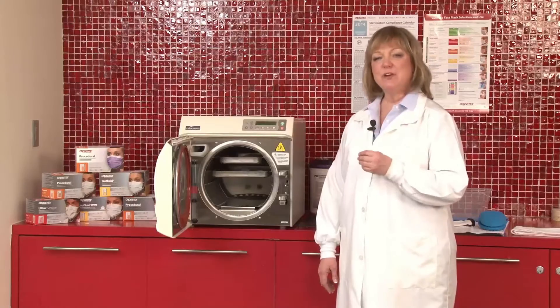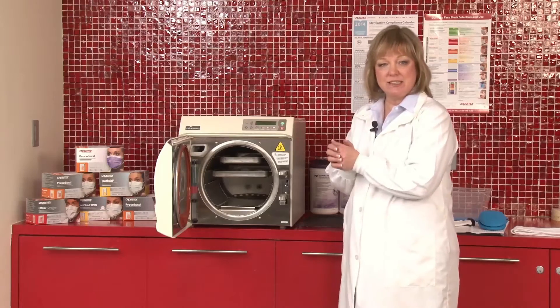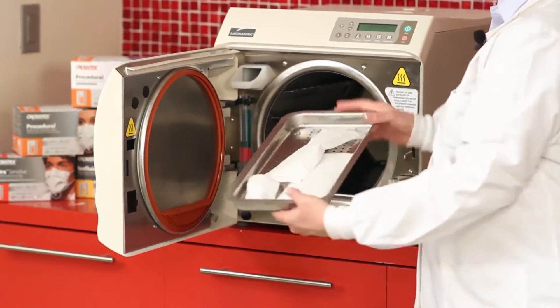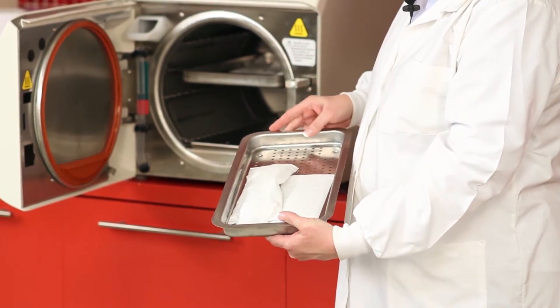So let's take a look. You can open up the sterilizer door. It's very important that you wait to make sure that the packs inside the sterilizer are totally dry, that you don't take a chance for wicking, because if you touch a damp pack, whatever bacteria or microbes are on your hand can be transported through the open pores of that paper. When the paper dries, the pores will actually close shut, which helps to maintain sterility inside the package. So when you remove the tray from the sterilizer, you want to do a visual inspection to make sure that all the paper looks dry, as you see in this tray.